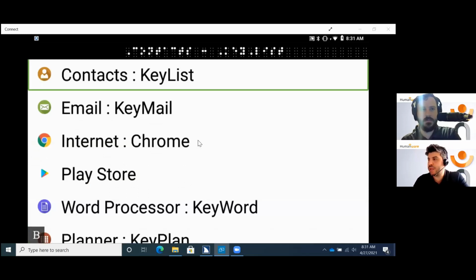And just to let everyone know, people may be thinking about which series introduces certain signs or words. There's a big list, again, in the teacher's handbook. It's also available on the HumanWare Buddy application that we're just going to touch base on in a moment, and it gives you a list of when those contractions are being introduced. So, for example, if a student wants to know where the ST sign comes into play, I think it's in book 2, I believe. Again, it's all listed there in the teacher's handbook. So without further ado, let's go on to the tracking of students' progress.